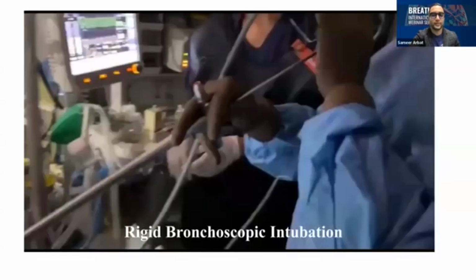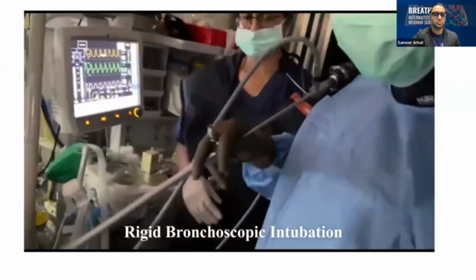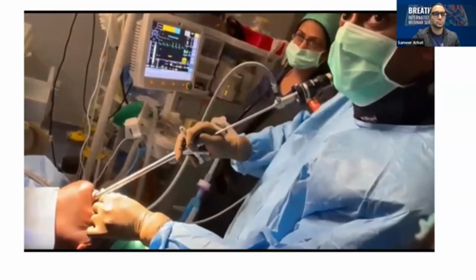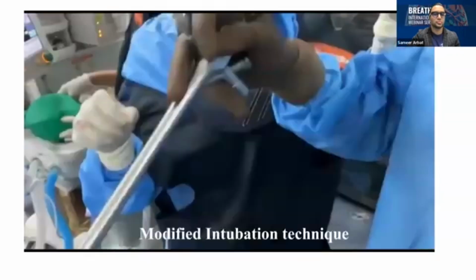Now I'll show how we really do the rigid bronchoscopic intubation. What I am showing you currently is the traditional way of rigid bronchoscopic intubation using the rigid telescope. As you can see from here, I am using the 3-finger technique, and I'm using my thumb as a fulcrum. And as I go inside, I make sure that I lateralize the vocal cord and enter inside.